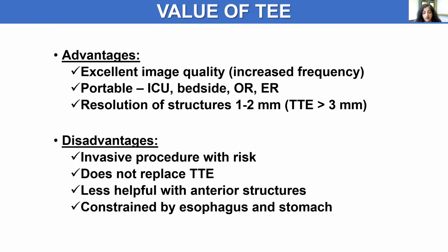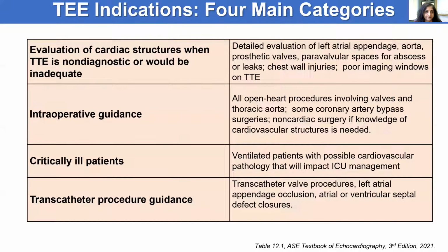The disadvantage of TEE is that it's an invasive procedure. There are risks of the TEE procedure itself as well as the sedation required. It doesn't replace TTE, it's often complementary, and it's less helpful with anterior structures. Structures that are further away from the esophagus are harder to evaluate. And finally, with TEE, you're limited by the constraints of the esophagus and the stomach, and physically what you can see from those two areas.